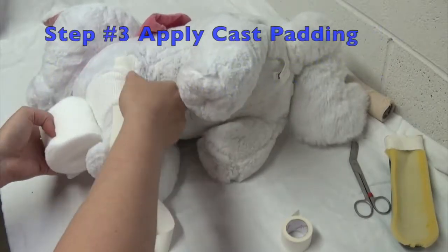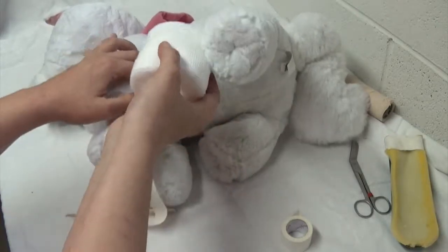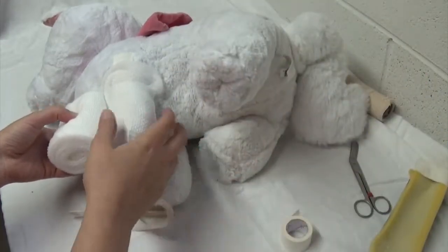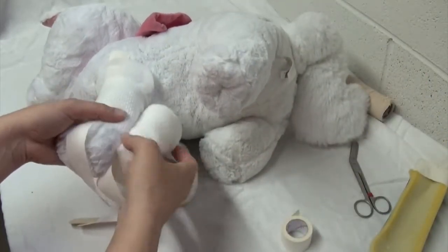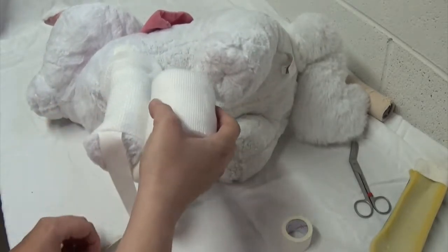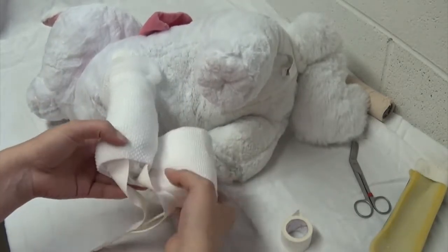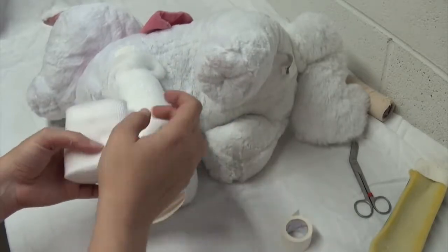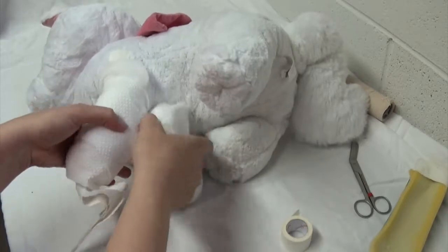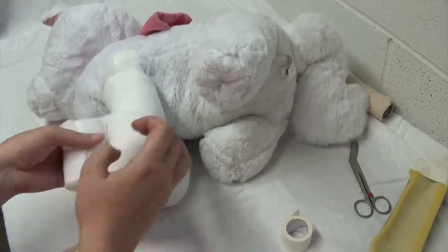Go ahead and place your cast padding. You want a pretty good thick layer to help prevent any pressure sores from the spoon splint itself. With every lap, overlap by 50% on the bandage. Check with your doctor whether they want you to include the toes or not. I'm going to add a couple of layers here because I don't want that spoon splint to cause any pressure sores for my patient.